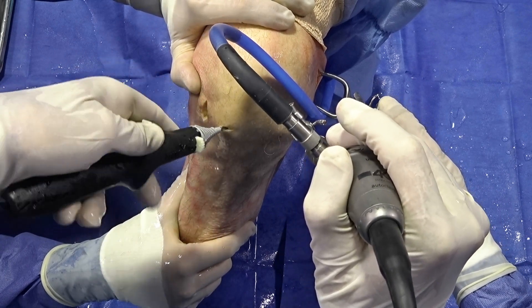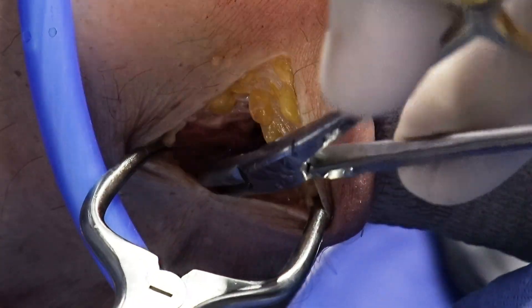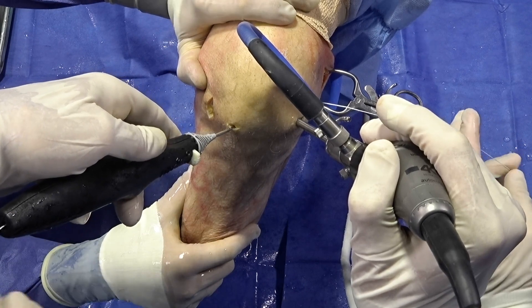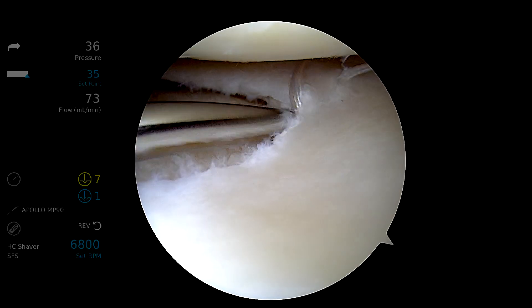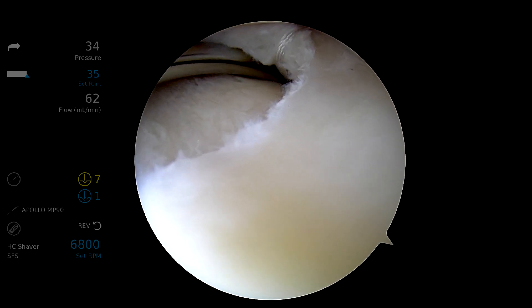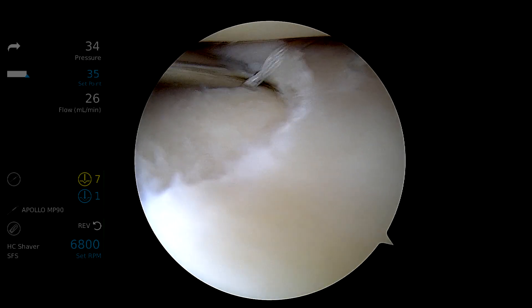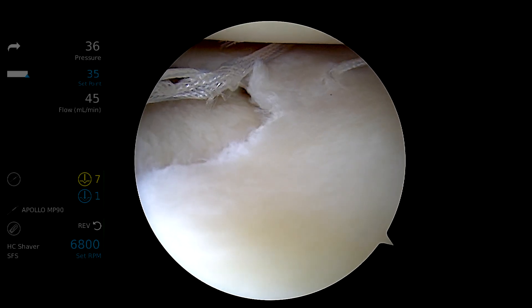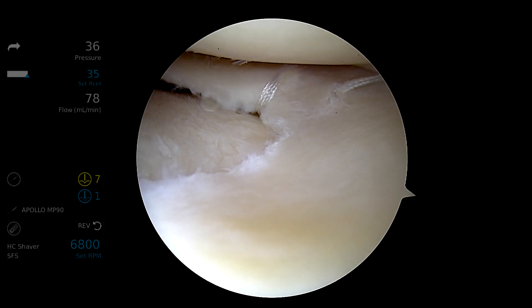The first stitch will go on the superior surface at the meniscus synovial junction and is retrieved through our posterolateral incision. Once that needle is removed, we load the second needle of the mini suture tape and get underneath the meniscus to place our second suture at that junction — you can see how quickly this can be performed. This allows the mini suture tape to compress a horizontal cleavage tear in a circumferential fashion, and we can adjust the tension accordingly.